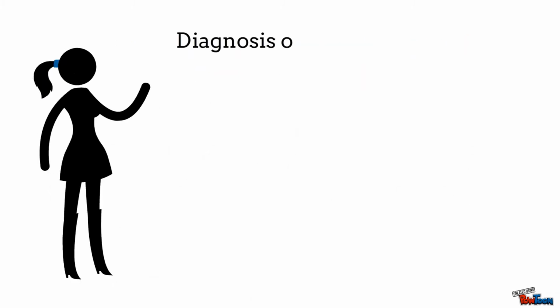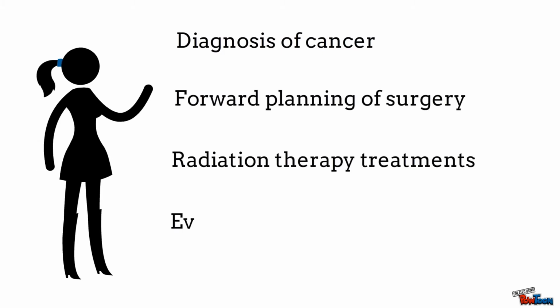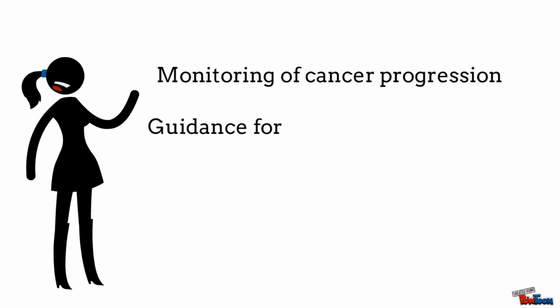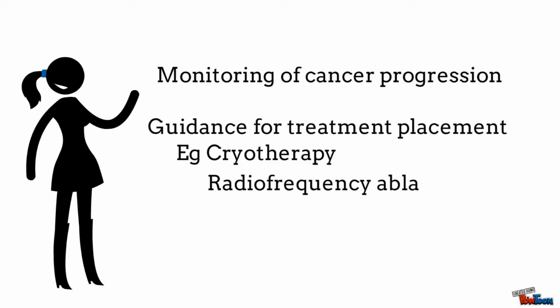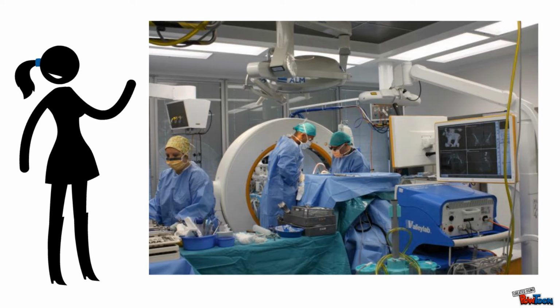The functions of CT scans include diagnosis of cancer, forward planning of surgical procedures, radiation therapy treatments, evaluation of cancer treatment effectiveness, monitoring cancer progression, guidance for the placement of local treatments such as cryotherapy, radiofrequency ablation, and radioactive seeds implantation, and visual aid for invasive surgical procedures, such as biopsies.